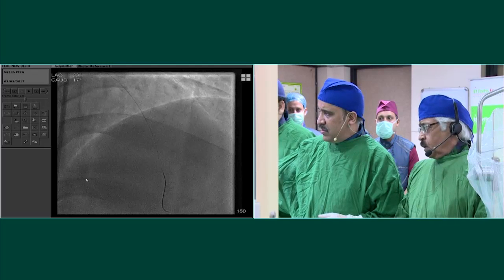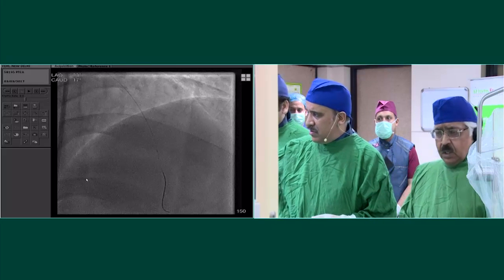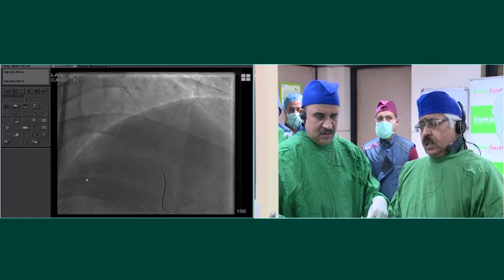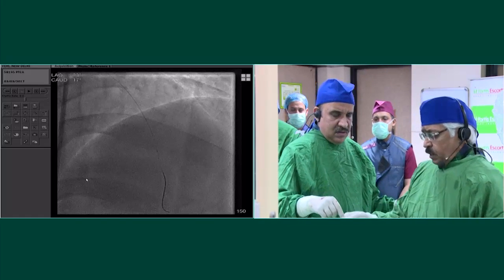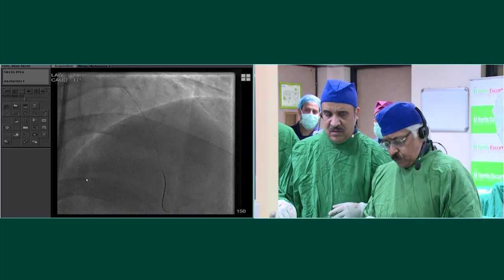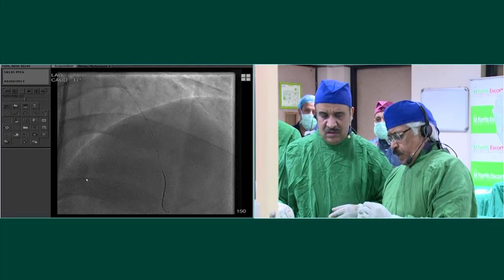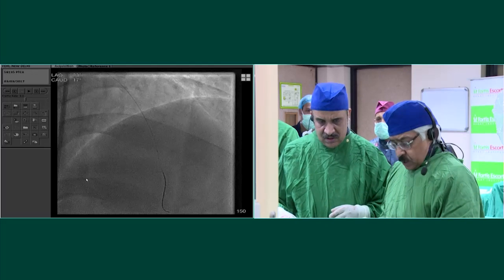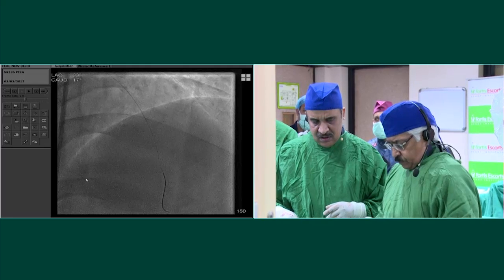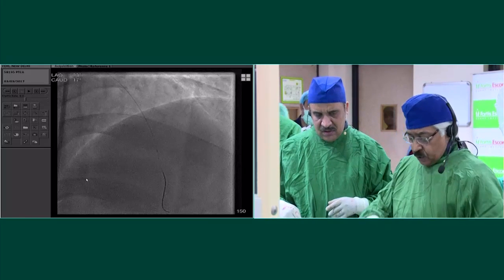Jean, we have a Flextome, and that's basically because of the ostia, and then we have the OCT to be done as well. We must not forget that. So even if we move away from me to the other lab, don't worry, because we're going to come back at the end to show the result, okay?